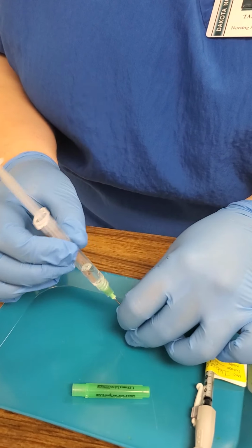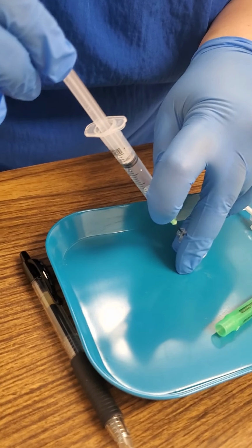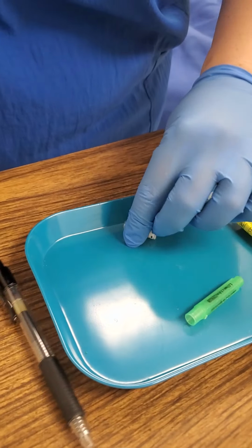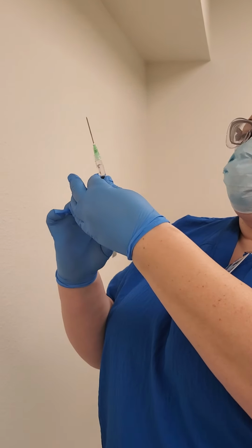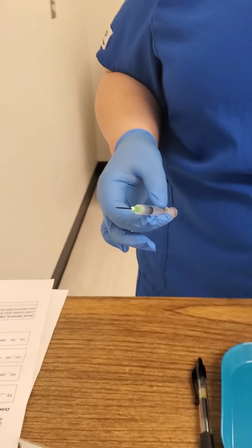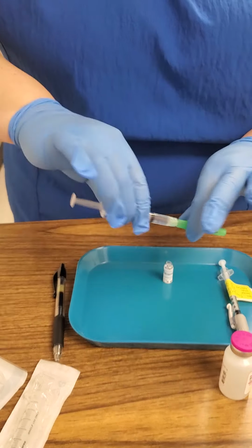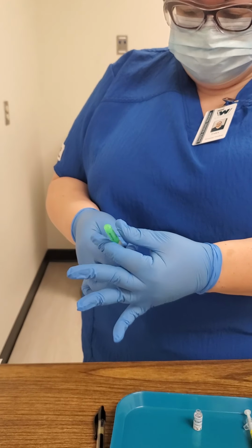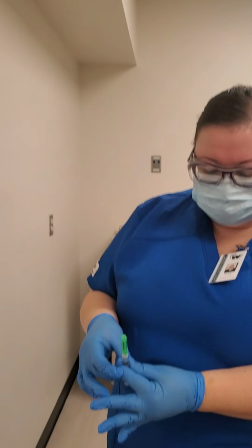Okay, I'm going to kind of turn it sideways here. Make sure I get it all out. I got quite a bit of air in here, so I'm going to try to get some of the air out. I'm going to recap that, switch my needle, and then I'll get all the air out. After I switch my needle, I'm going to pull back a little bit on it before switching my needle.